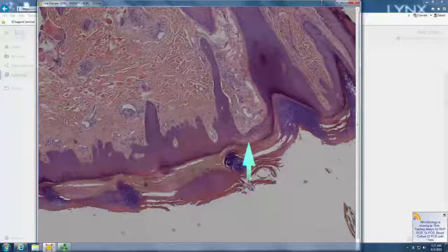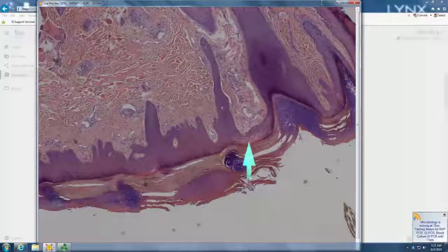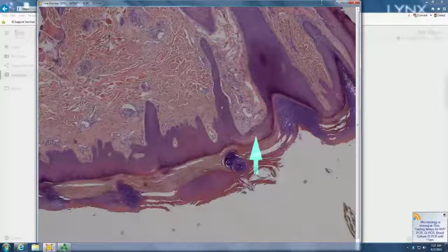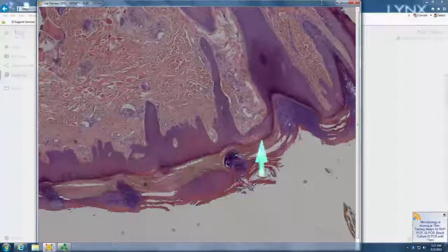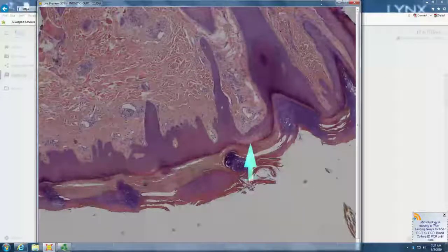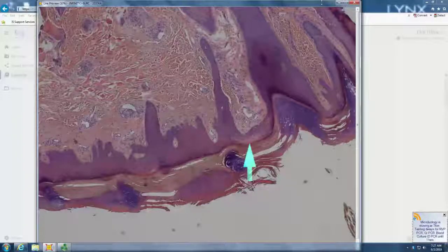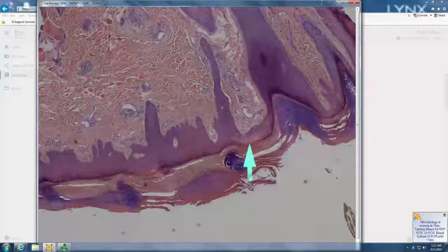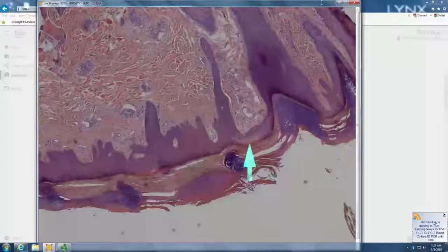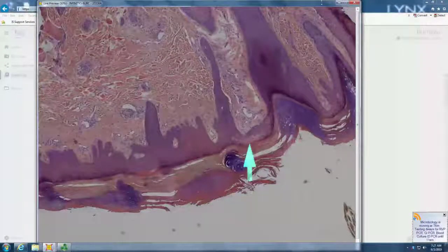No, that's fingernail work, right? That's excoriation. So anytime you have these superficial red or pink areas where it should be blue, granulosum, that's excoriation. That's fingernail work. So if you want to know what death will look like, it's red, right? Death is red, at least in H&E.